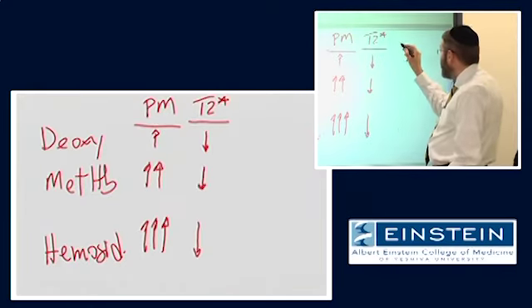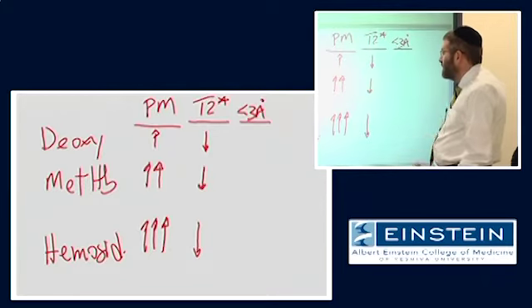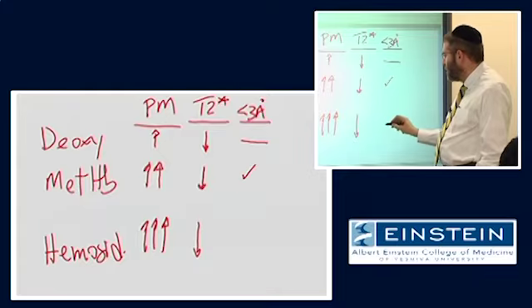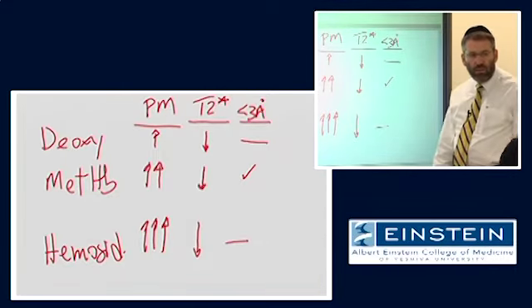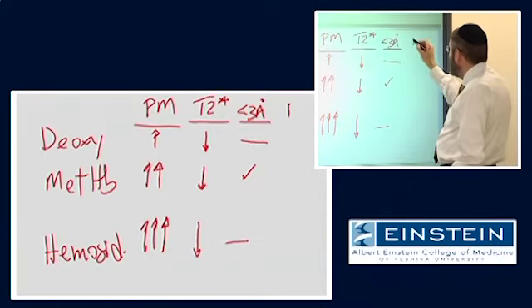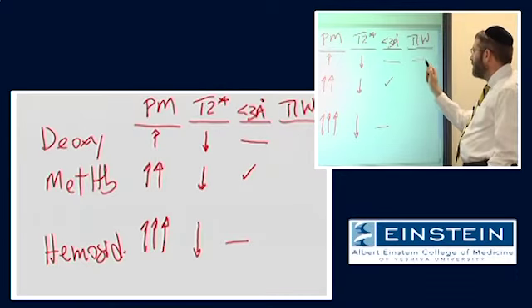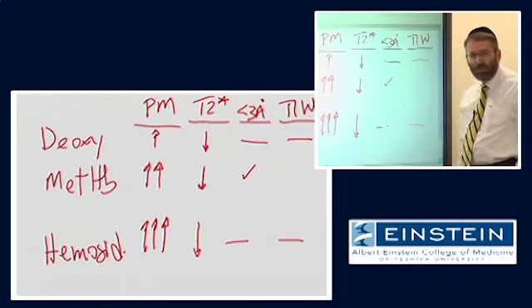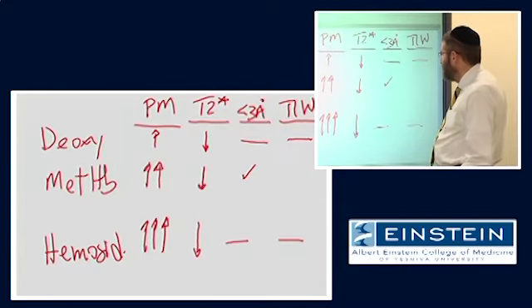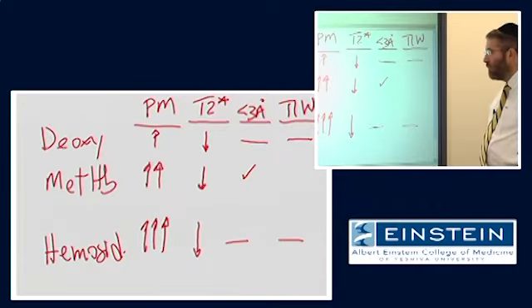And then if we ask a second question about this 3 angstrom rule, the only one that meets that criteria is methemoglobin. So if we would look at a T1 sensitive image, we would expect to see no effect from hemosiderin or deoxygenated hemoglobin on our T1 weighted image, whereas we would see what effect on signal amplitude if we have methemoglobin?